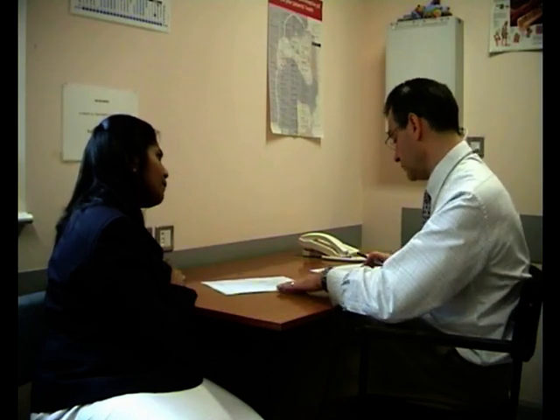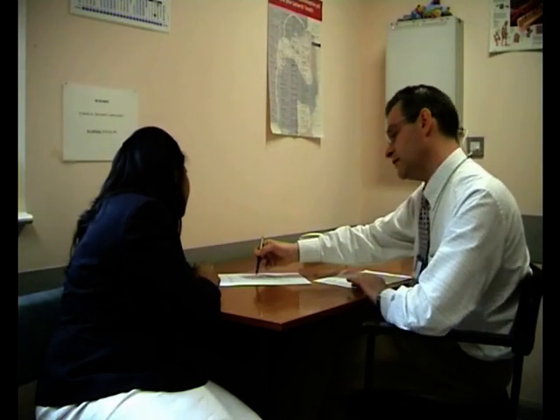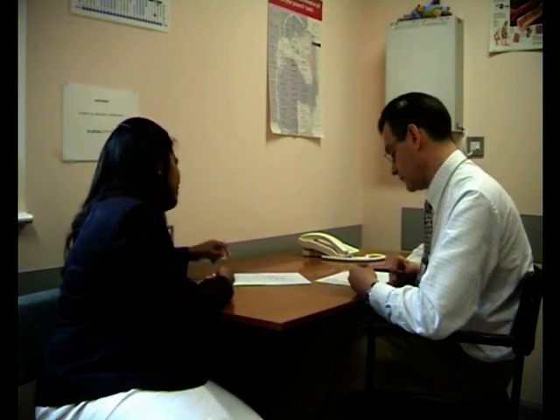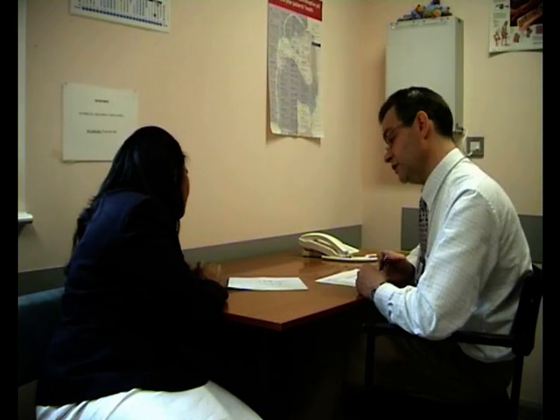So you were going on to tell me what might be the cause of that, and one cause you think might be detrusor instability, or nowadays we call it detrusor overactivity. Okay, and do you know what the other possible explanations for this might be? That we haven't zeroed the... Well, there could be technical issues, but I think we can assume that this isn't to do with that.